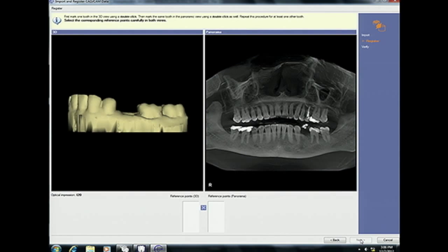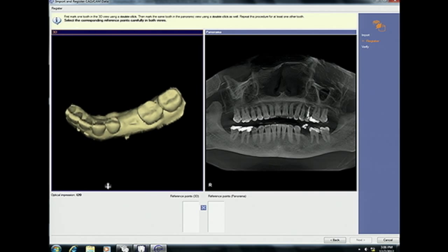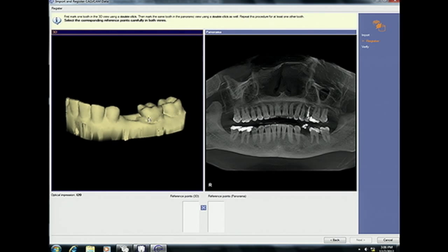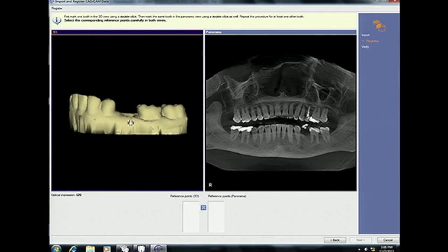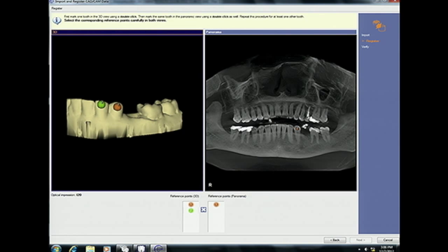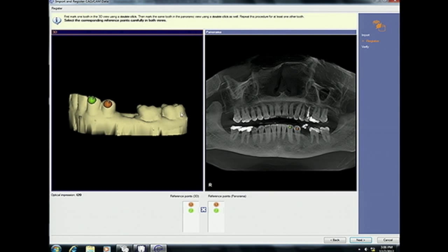Once we've opened up the CAD-CAM SSI file, the very next screen allows us to register the datasets. The dataset on the left is an optical impression from CEREC — its surface detail of the clinical crowns of the teeth, but also the soft tissue that the patient presents with. The dataset on the right is the radiographic data from the GALILEOS which we just took. The software allows us to match the datasets together, but we have to specify specific markers on common anatomic points. I'm double-clicking on tooth number 21 in the CEREC data and also on a similar point in the radiographic data. I'll do the same for tooth number 22, and the software only needs two markers per dataset, but I like to add more so the software has a better understanding of how the datasets match together.